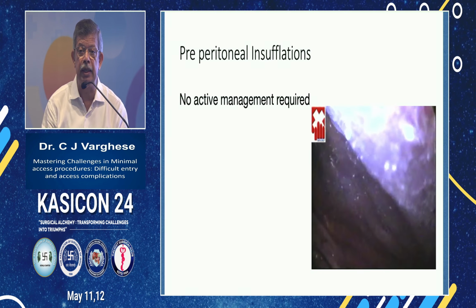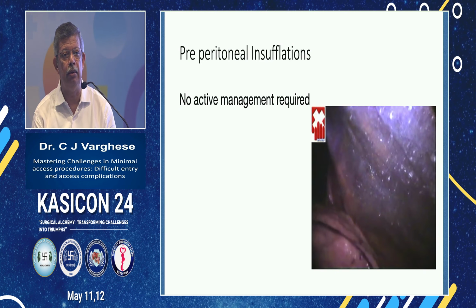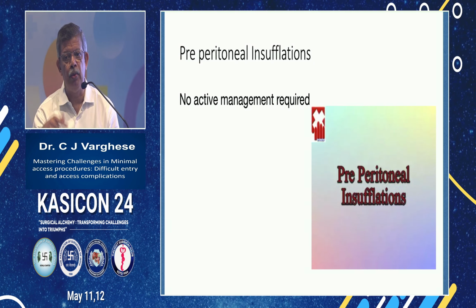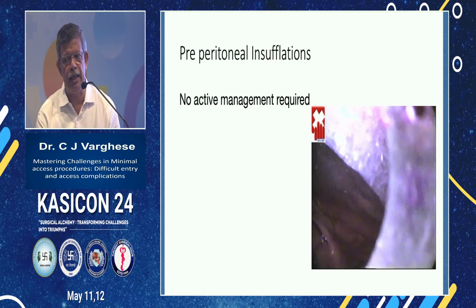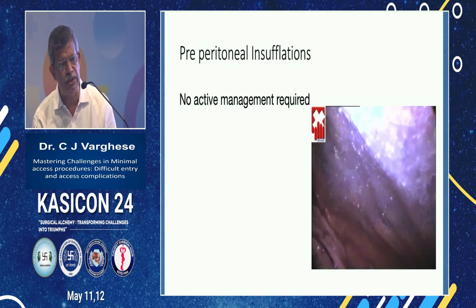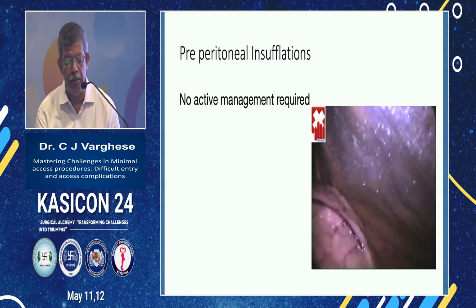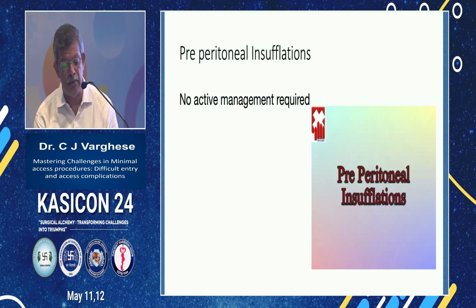And even in cases where we do fundoplication or surgery for achalasia, sometimes a pleural opening is made and then the gas gets into the chest. No need for a chest tube insertion, it gets absorbed. So the carbon dioxide all gets absorbed, so it's not a big deal.